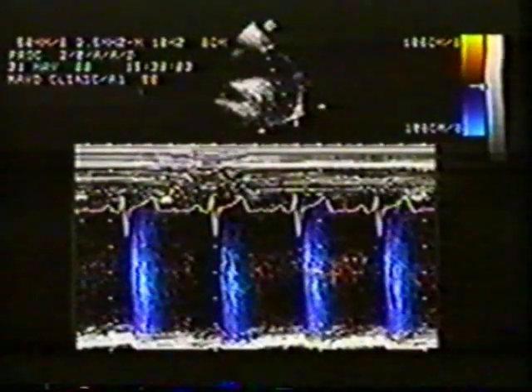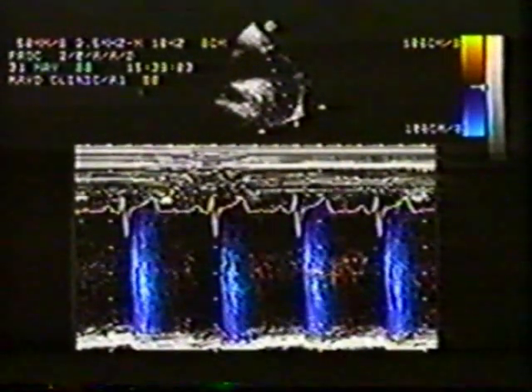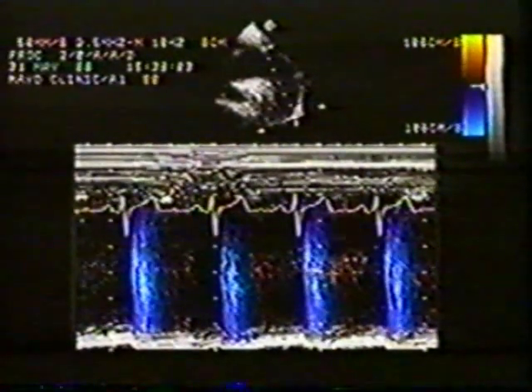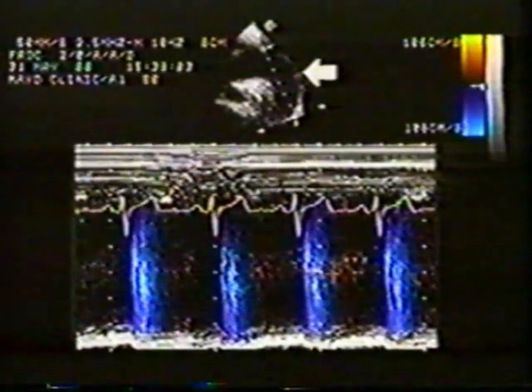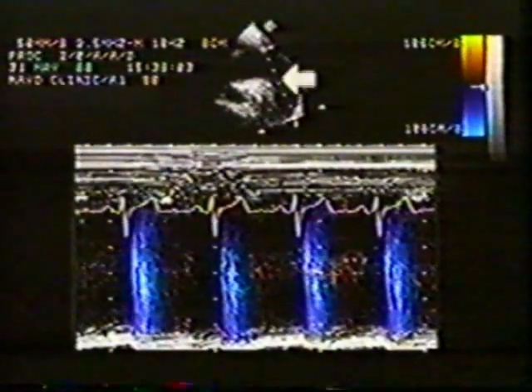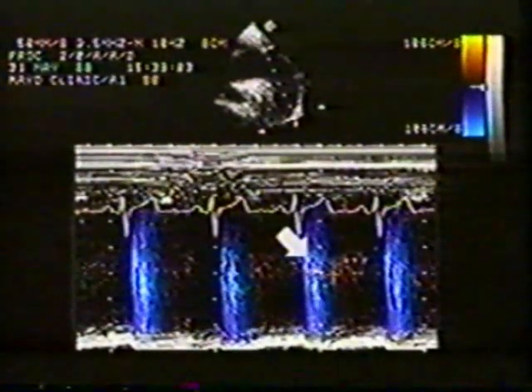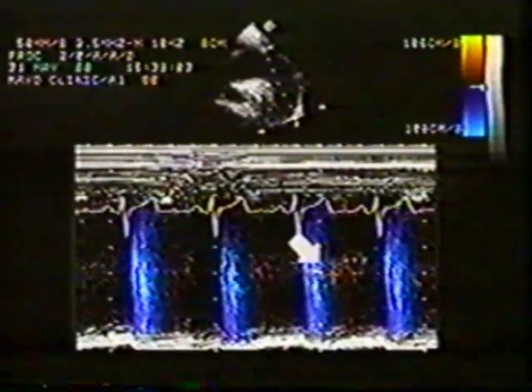The flow reversal in the aortic arch can be demonstrated by both pulse Doppler and color flow imaging. This is a normal arch examination with the transducer in the suprasternal notch. The cursor in the descending aorta is generating this color M mode. Several cycles show slight, early diastolic flow reversal, encoded in red because the flow is toward the transducer.